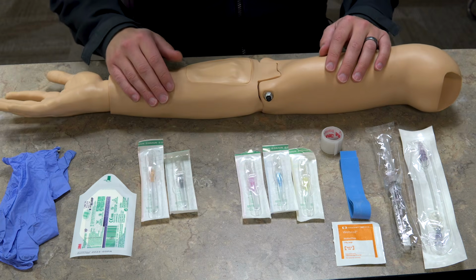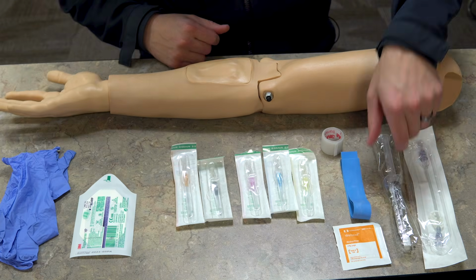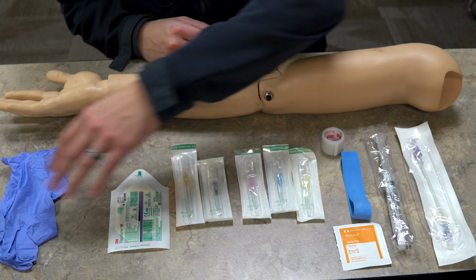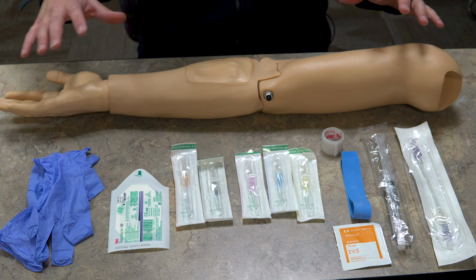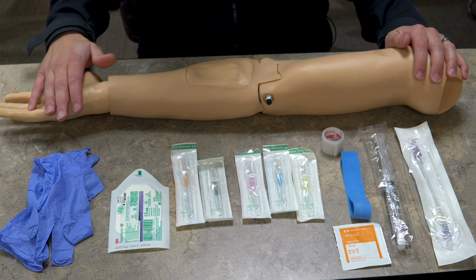Looking at some of the other supplies we have here, we have an alcohol swab, a tourniquet, tape, saline flush, a loop, Tegaderm, and then our PPE, so in this case, our gloves. Now, one of the first things we're gonna do before we start an IV is set everything up, and we wanna make sure we have all our ducks in a row before we try to start an IV.